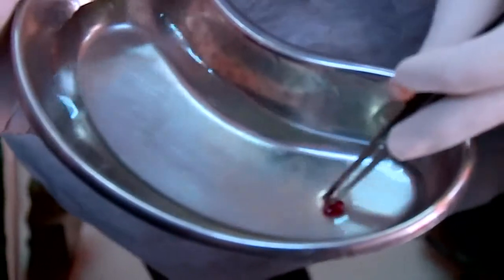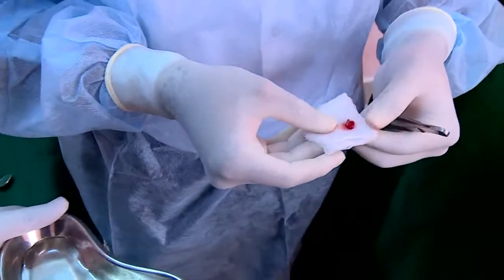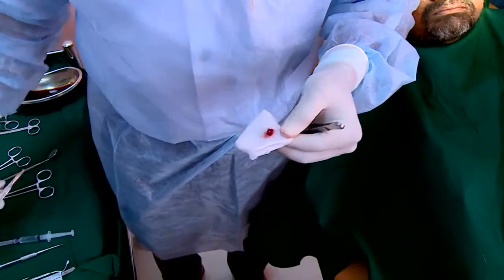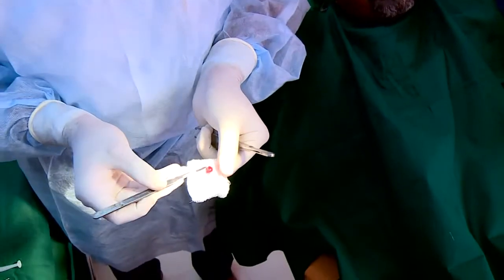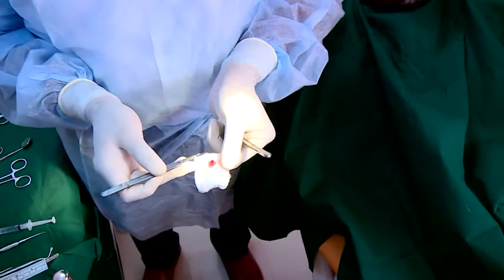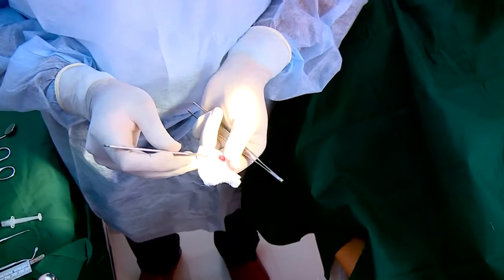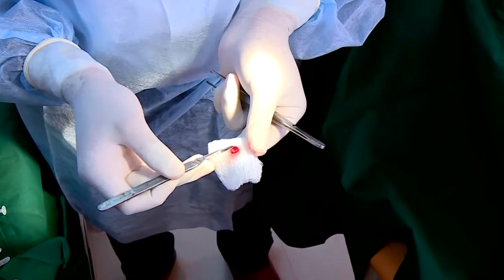So that's the specimen. You just rinse it in saline and immediately transfer it. I just want to show the specimen once before we transfer it to the formalin. If you see the length, the depth of the specimen is almost similar every way. So we have the mucosa and the fibrous part, and the depth of the mucosa remains almost the same every way.